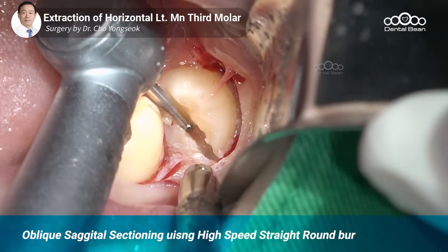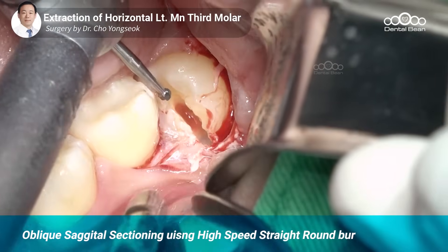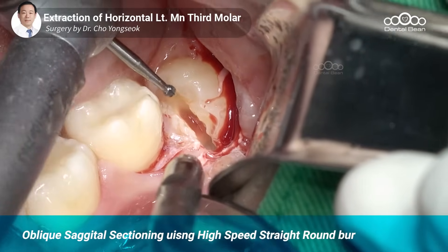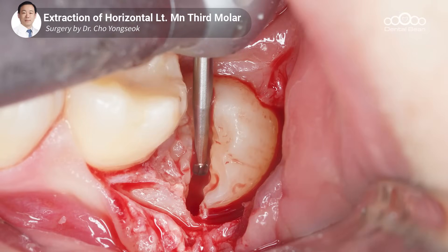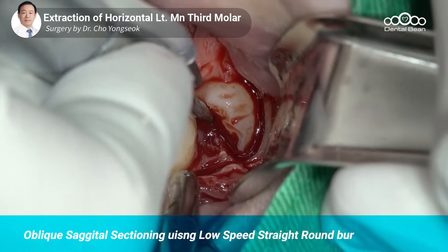하이스피드바만으로는 지금 깊이를 장착할 수가 없습니다. 일단은 에나멜 부위는 하이스피드바를 했는데 로우스피드를 써야 되겠어요. 오블리크 세지탈을 끝내겠습니다.